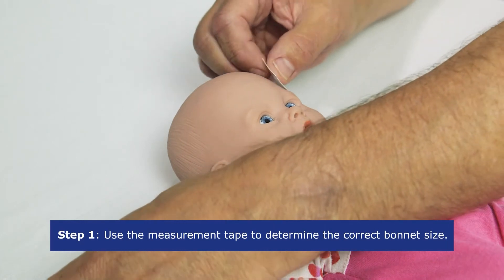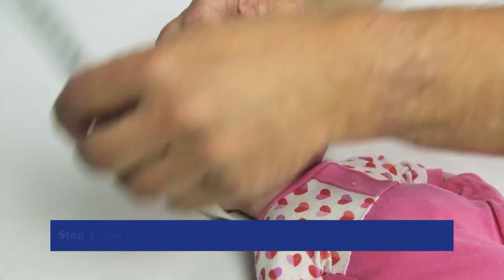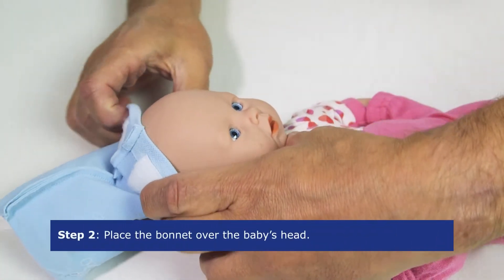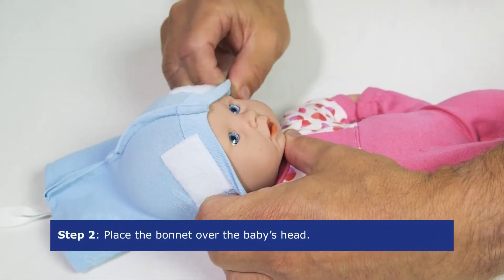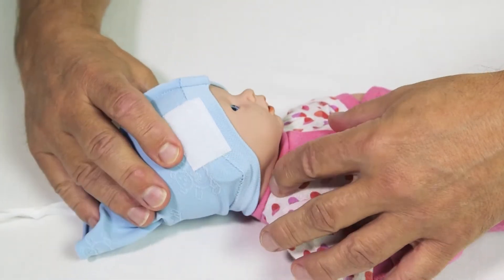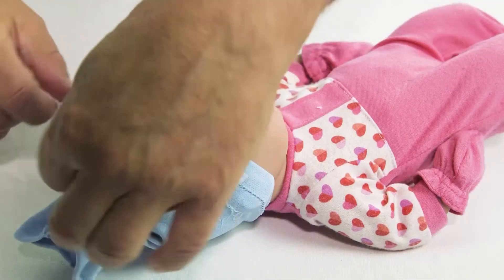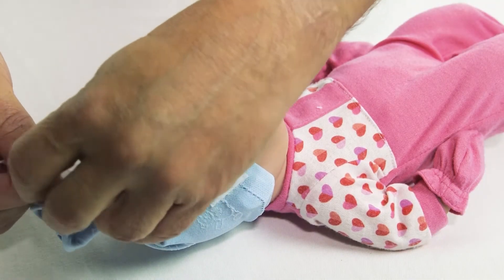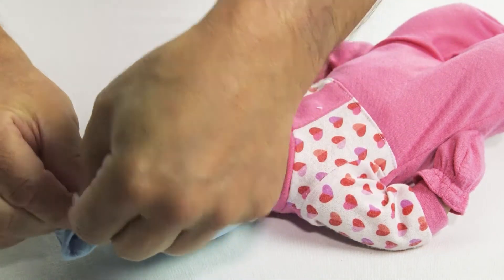In this case you will need the blue bonnet. Place the bonnet over the baby's head with the two velcro strips at the front, making sure the bonnet covers the ears and the nape of the neck. If no intravenous access to the head is required, gently close the bonnet with the attached ribbons so that it covers the top of the head.